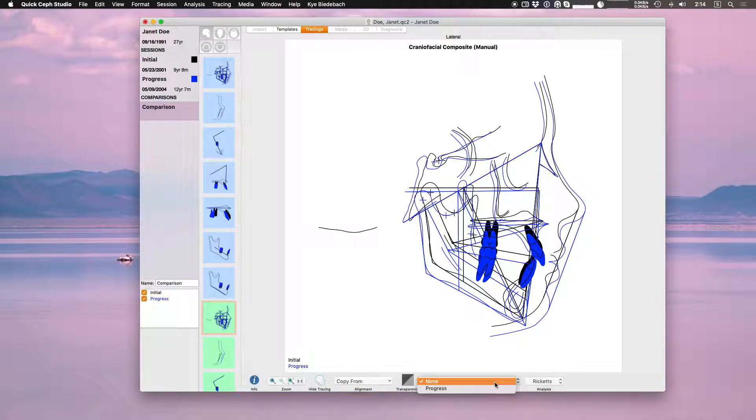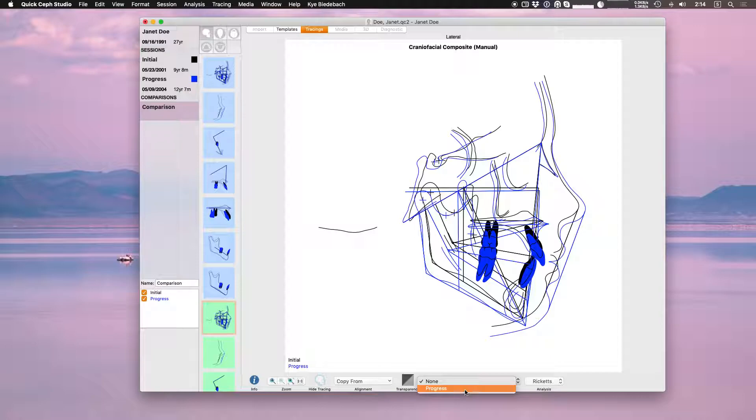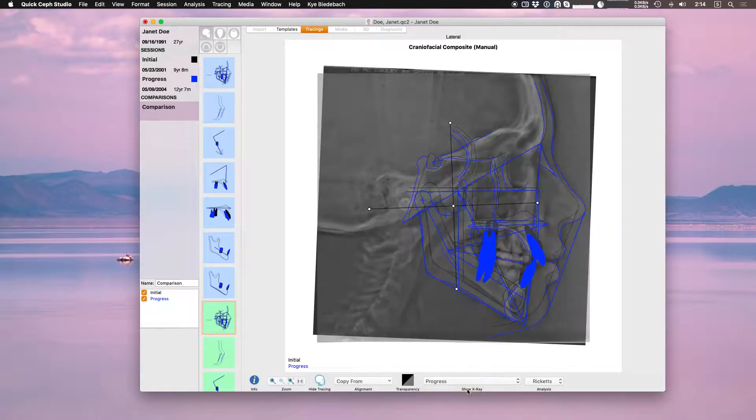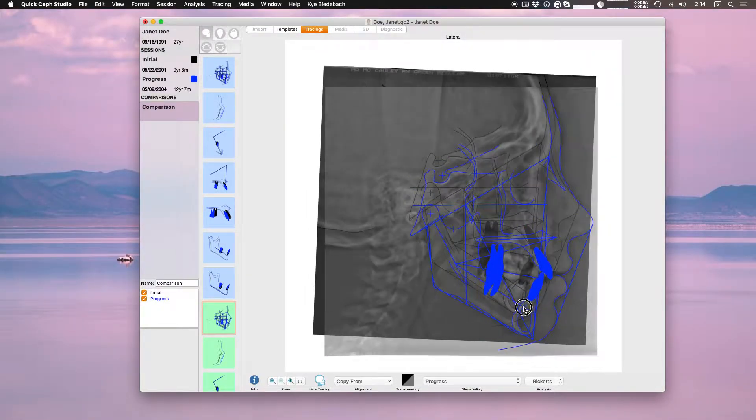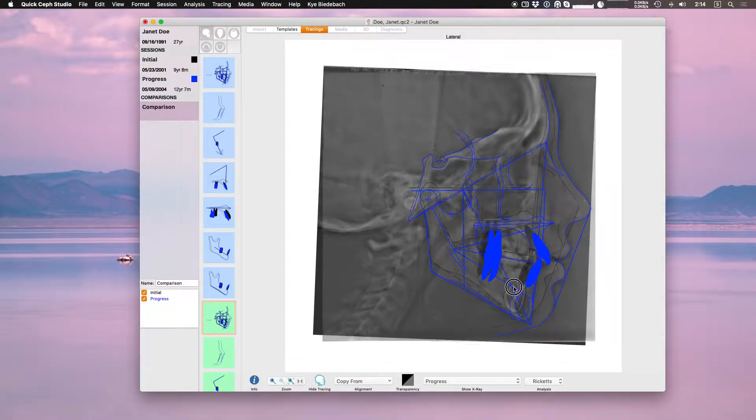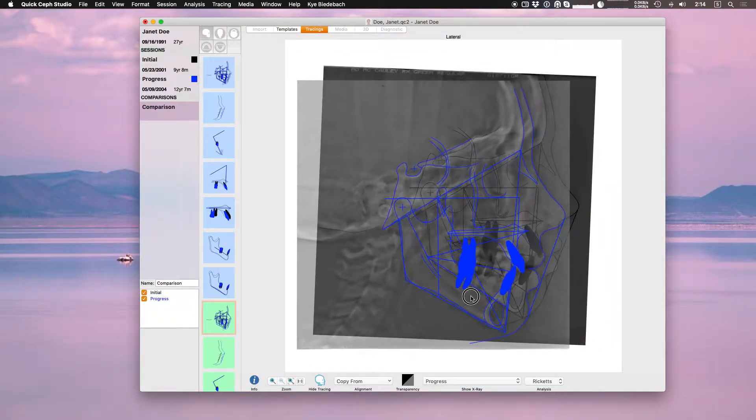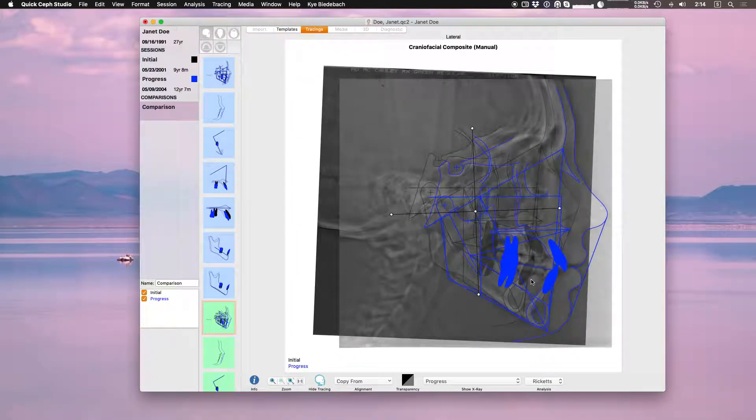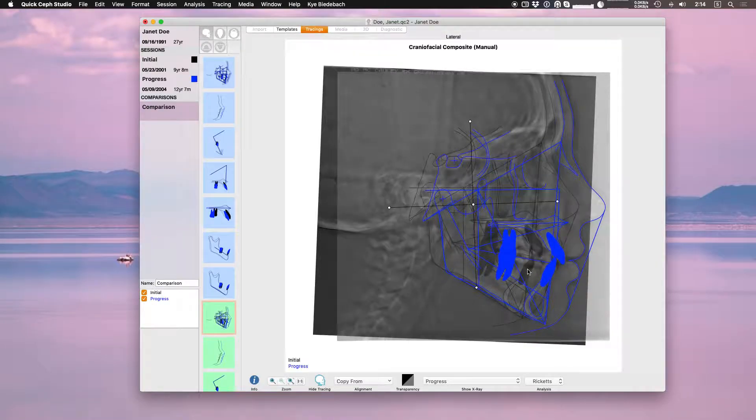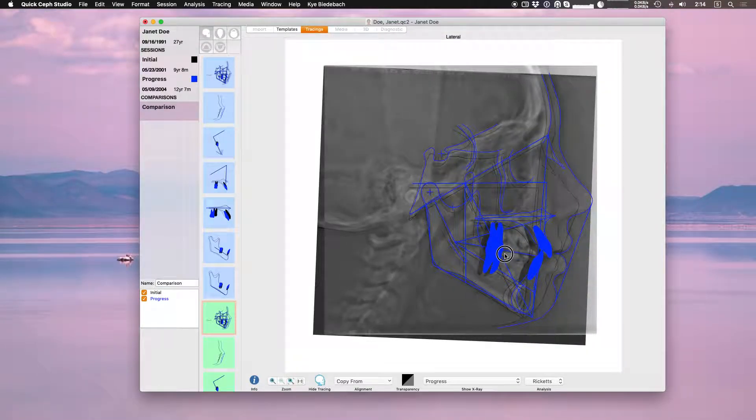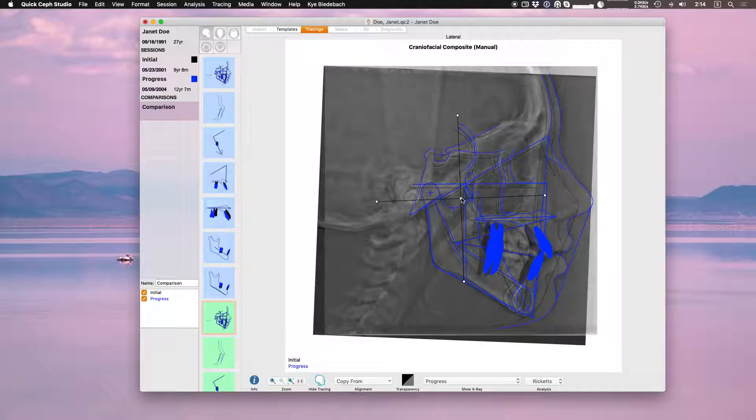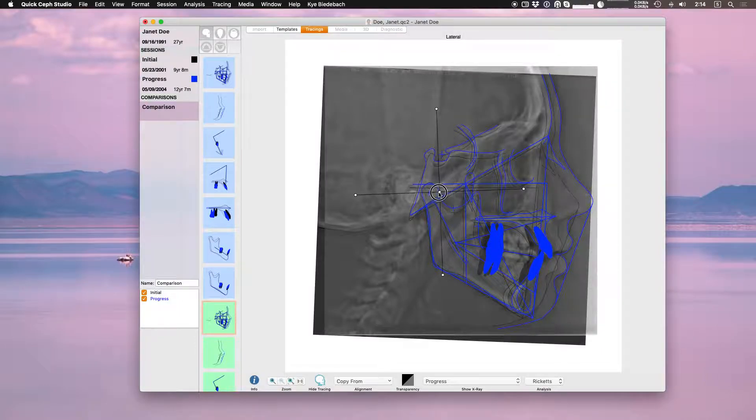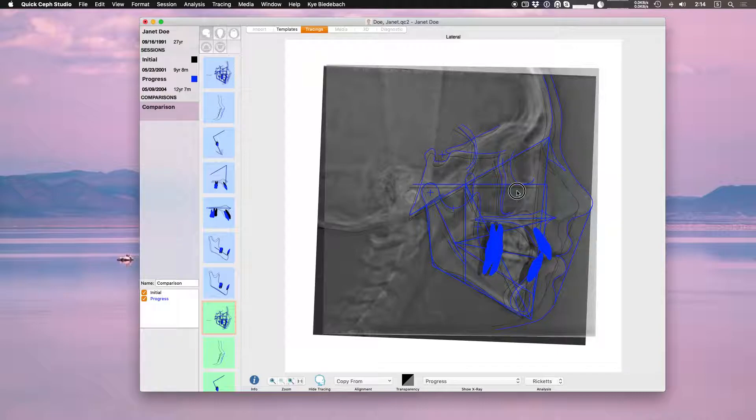Right here under show x-ray, the top session initial is always going to be on the bottom and then this is saying what other x-ray do you want to put on top of it. We only have progress in this case, so if I choose progress now it's putting the progress x-ray right on top and you can see I can move this manually just like I'm working on a light table. If I want to go by hinge axis I can line up the hinge axis and then this is my rotation. I can rotate right around the hinge axis if I want to rotate it slightly.